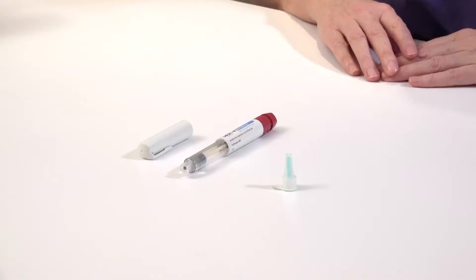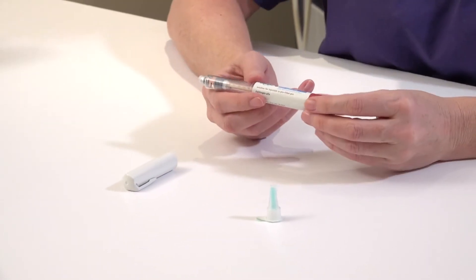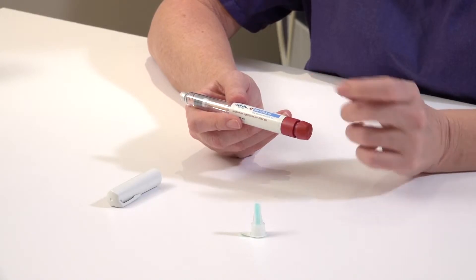I'm going to show you how to administer Gonal F. Gonal F comes in a pre-filled pen and it comes in three settings: 300 units, 450 units, and 900 units. Depending on the dose your doctor has prescribed and the number of units in the pen, it will vary how many doses you will get from one pen. These pens are intended for multi-dose usage.